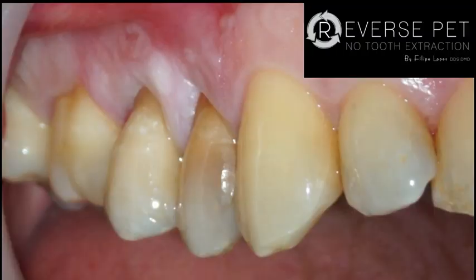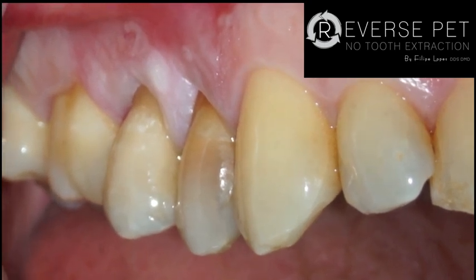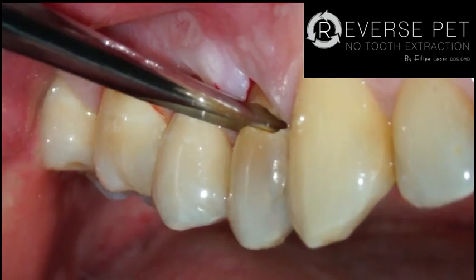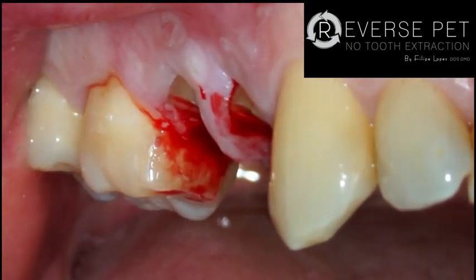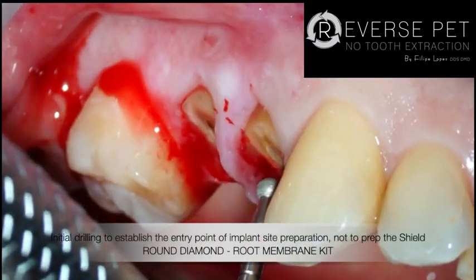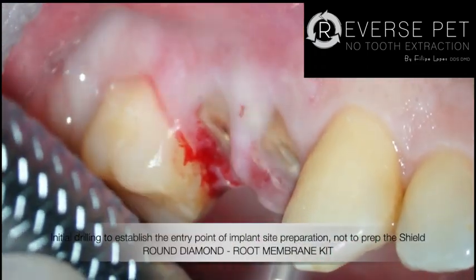Well, back to our case. So let's see what I did. I did partial extraction therapy, okay, but this time with no tooth extraction. No part of the tooth, no fragment was extracted, as you'll see. So let's see the step by step of this procedure. First thing is to cut the teeth transversally. Once you remove it, you're in good shape to proceed with the procedure.